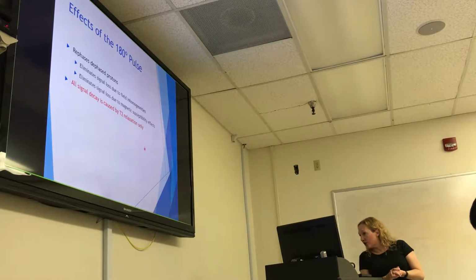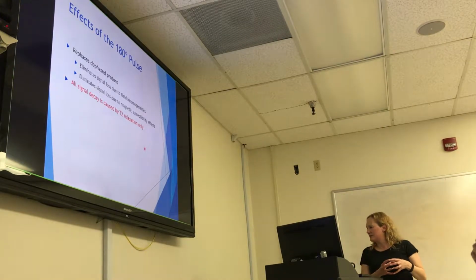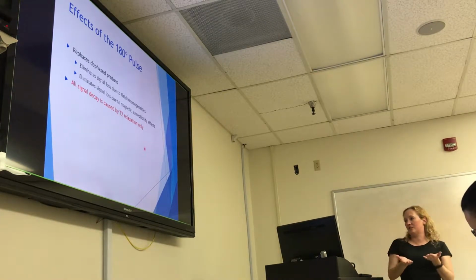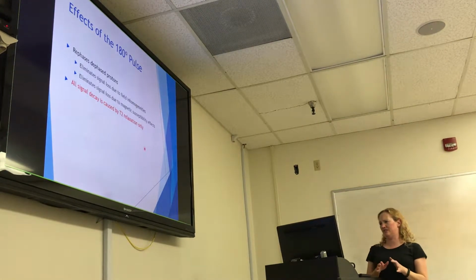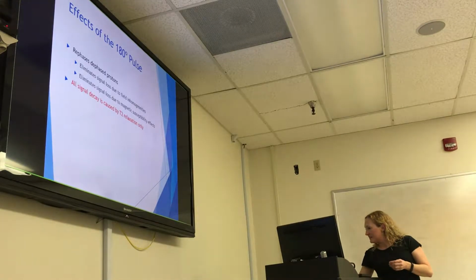Another question from the homework: how is T2 dephasing reduced if the NMV is still in the transverse plane, 90 degrees from B sub 0? Well, the dephasing is what reduces the signal. But again, that's still in the transverse plane, still 90 degrees from B sub 0. So the T2 is just a dephasing that reduces that net magnetic vector, that signal. Spin-spin decay goes away permanently.